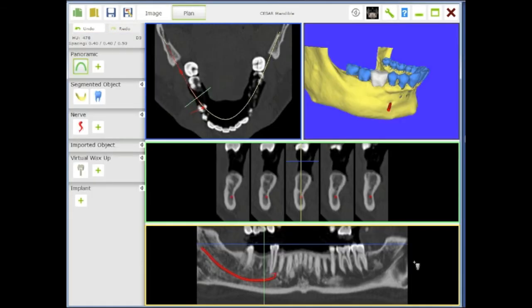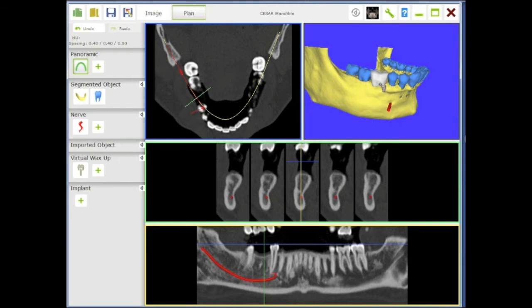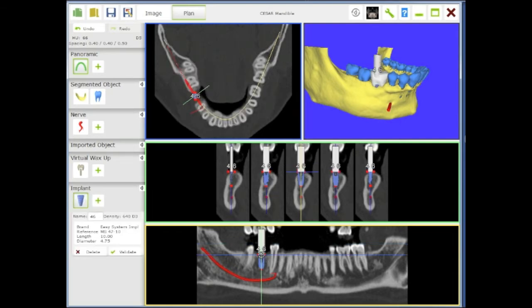You validate and then you can click wherever you want in 2D, in 3D, wherever you want. You click on top of the bone and you have your implant which is in place. It's not fully adapted, so you will need to adapt it.